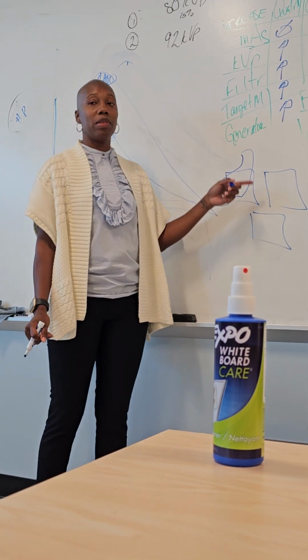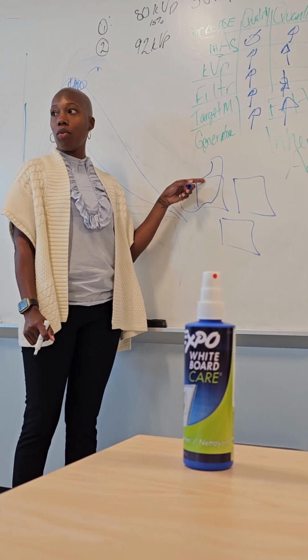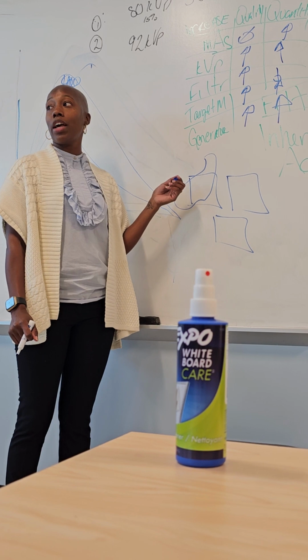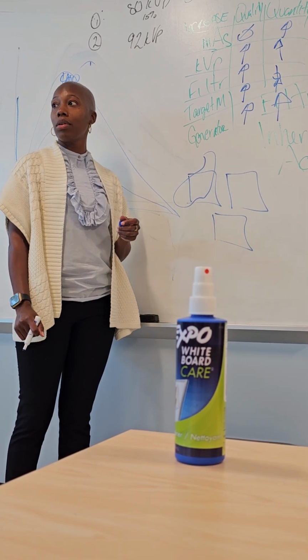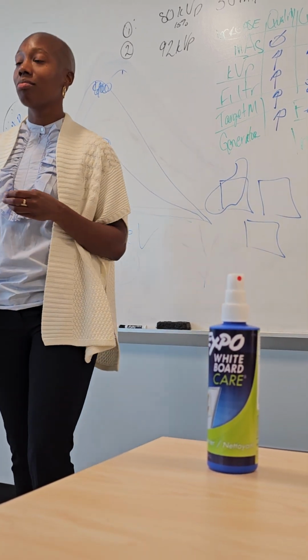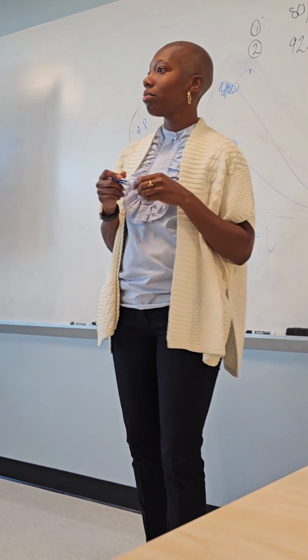So this is the importance of positioning. Again, if you're doing a chest, you want to make sure the 2 lung fields are over these, right? Spine, here. Even if you're doing the chest, where's your heart? It's to the left, but it's usually around the center chamber. It's got to penetrate through what? Blood tissue, right? Those are absorbers, they're thick, right? So positioning is important.